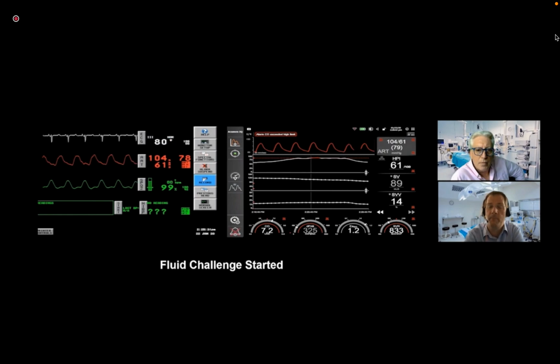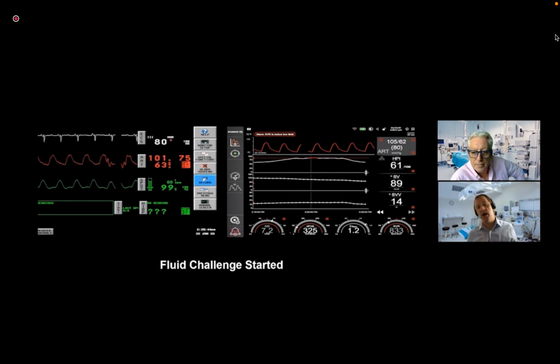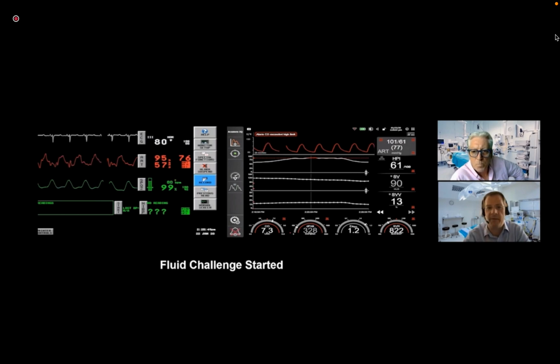Okay, so heart rate's okay, everything else is looking all right. If the Ea dyn was 0.8, I'd open up my roller clamp and let the fluid run in while giving a little squeeze of phenylephrine, just a little hit of something. No, I think so. We've got a patient that's preload responsive, Monty. We're giving that fluid, absolutely the right thing to do, but it's not going to fix blood pressure if Ea dyn is low. And so then we've got two things to think of. Is it contractility or is it some vasoplegia?